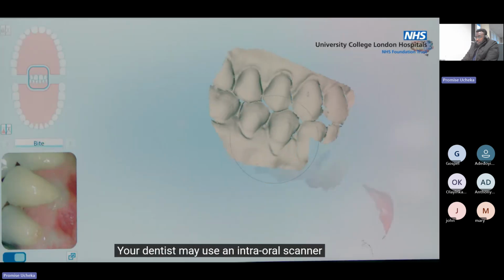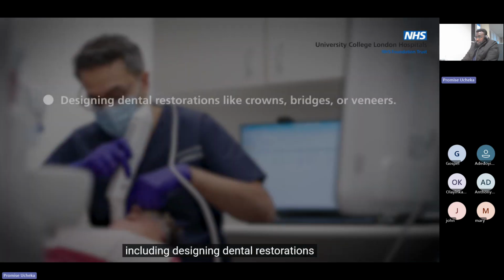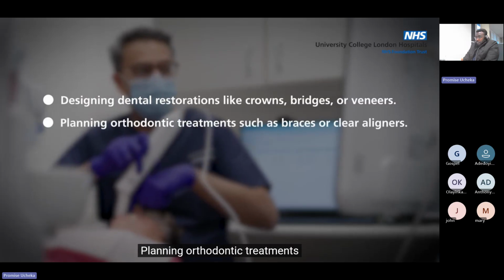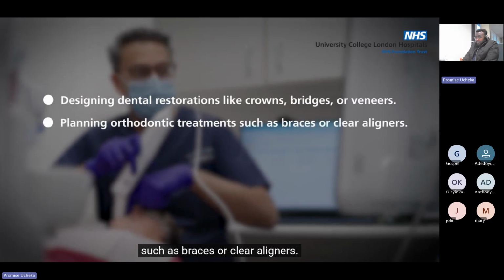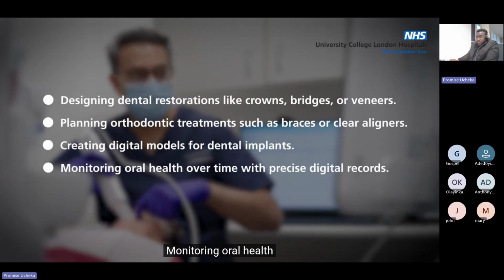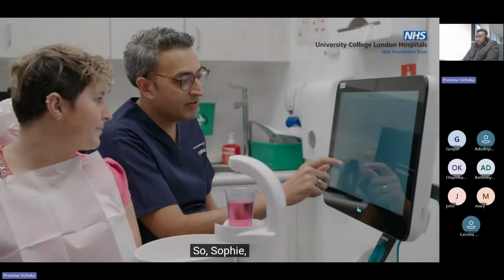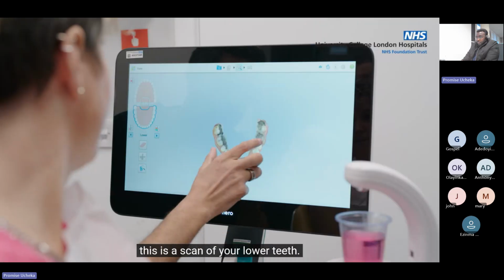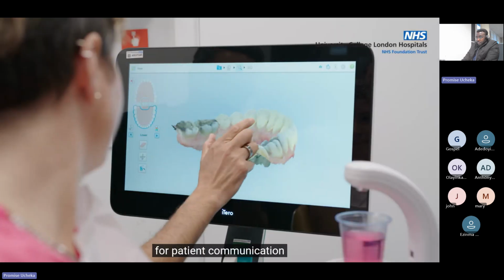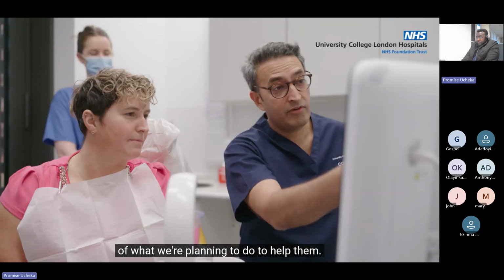Your dentist may use an intraoral scanner for various purposes, including designing dental restorations like crowns, bridges, or veneers, planning orthodontic treatments such as braces or clear aligners, creating digital models for dental implants, monitoring oral health over time with precise digital records. So Sophie, this is a scan of your lower teeth. It's very, very clean. It's a very helpful tool for patient communication, and this allows patients to have an understanding of what we're planning to do to help them.